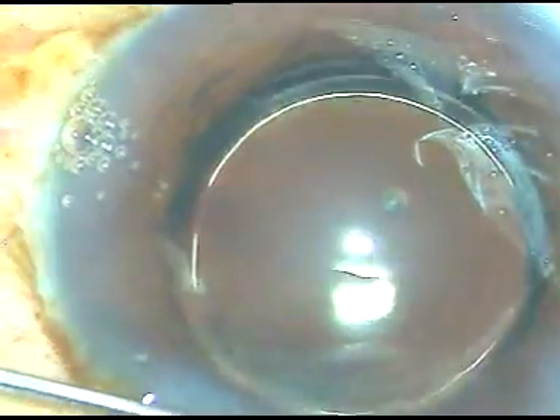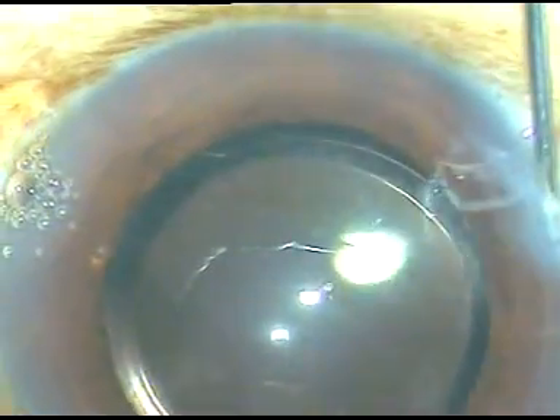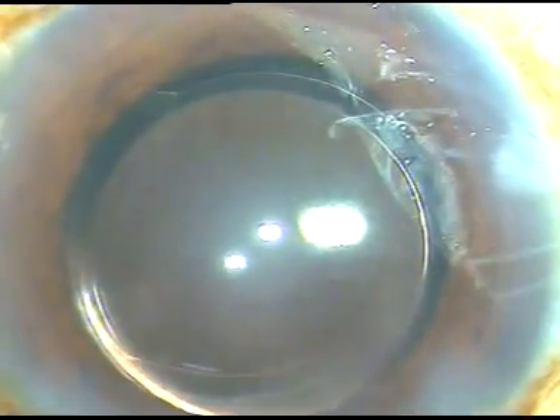I am hydrating these side ports to make these zones water tight. This is the final wash, and at higher magnification you can see some viscoelastic substance that sticks to the posterior surface of the cornea — on the corneal endothelium — coming out during this final wash. Thank you very much for watching; I hope this video will help you in developing your surgical skills.